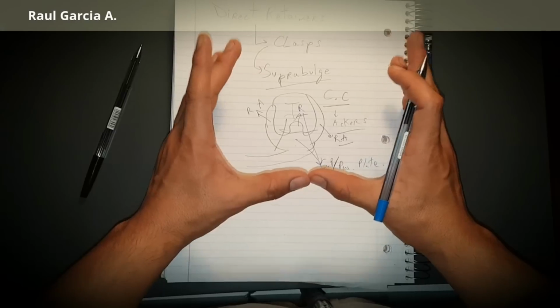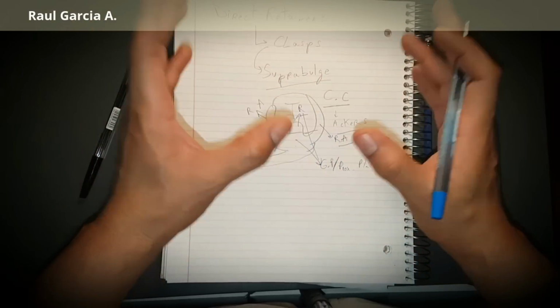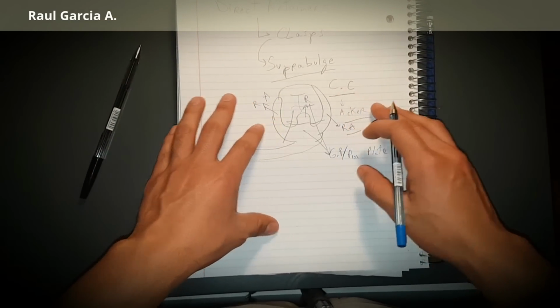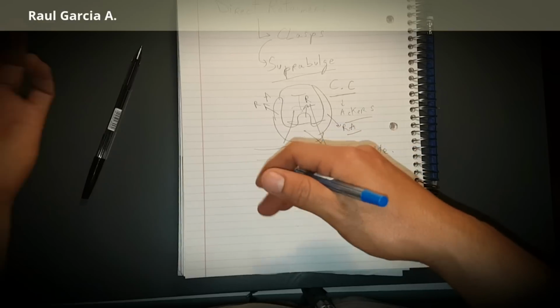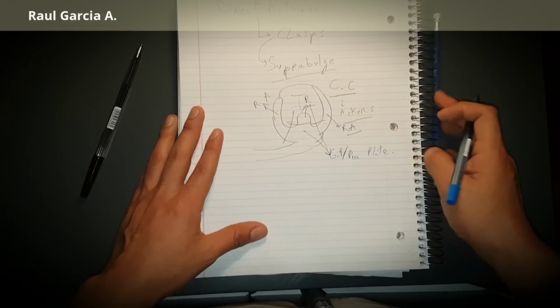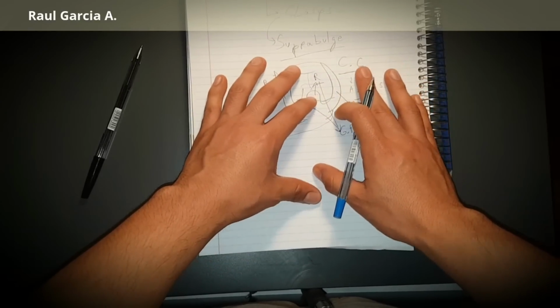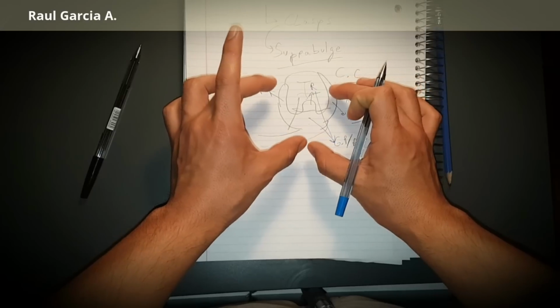So now that you guys know this, I'm going to start talking about the other ones. There is a lot of confusion when we ask, how do I draw an RPA combination clasp, which is a wrought wire? Starting from this point, you know that the cast circumferential is all together, one single structure.